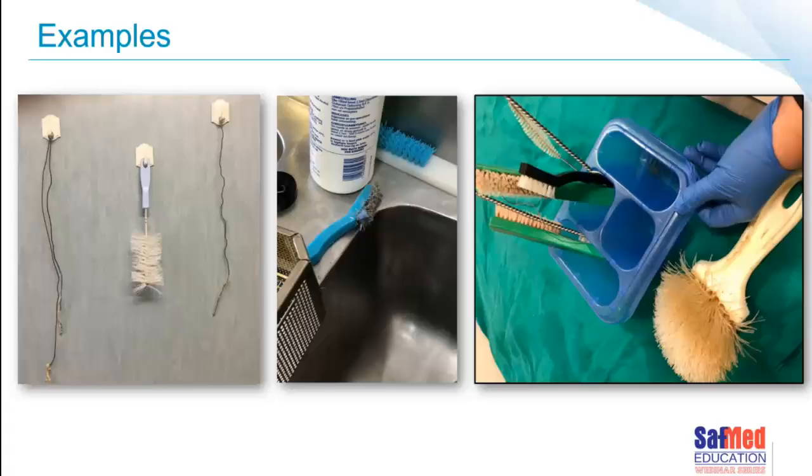That's a domestic brush. The handle you can see is badly scored. So how on earth are we going to get the handle clean? If you look carefully, you might be able to see crossing over this not so clean green brush is in fact a piece of suture material that was tangled in amongst all of these brushes on the day that I did the audit. Is this really the type of brush that we want to use? I don't think so.